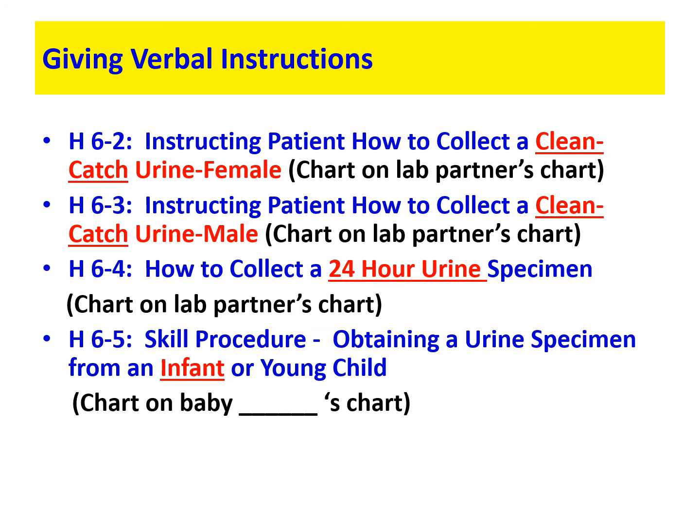So they urinate, and then any and every time they urinate after that morning urine, they collect it, place it into the 24-hour urine container, and if it doesn't have a preservative in it, they keep it in the refrigerator. They keep it all through the day and any time during the night, anytime they urinate. That next morning, when they wake up, say around the same time, 5:30, and they go to the bathroom, they do collect that specimen. That's the last one they collect. It is added to that 24-hour urine jug, and then they bring that in for testing.